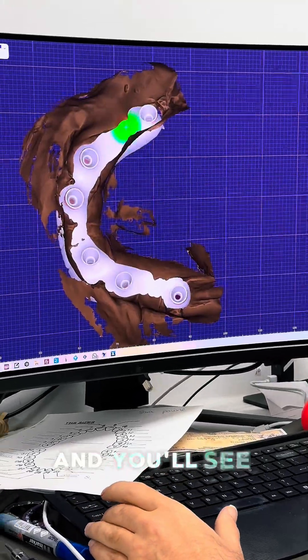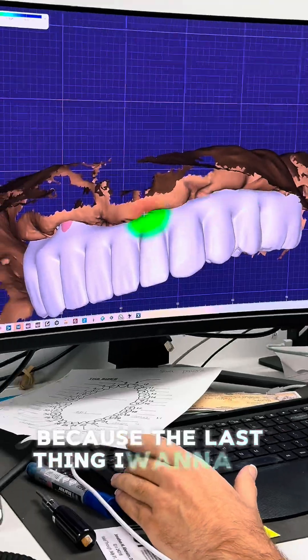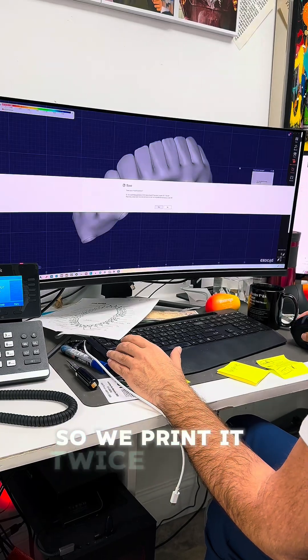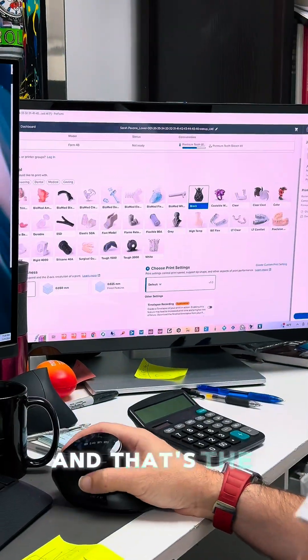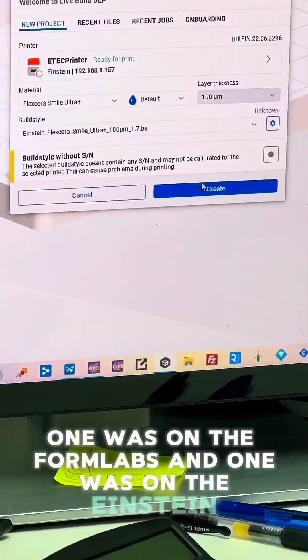Now it's time to smooth out everything and then print - and I print two copies on two different printers, because the last thing I want is a failed print and lose another 30 minutes. So we print it twice on two different printers, because digital dentistry is not perfect and we're just trying to make it less so. I printed on both the Form Labs and the Einstein printers.